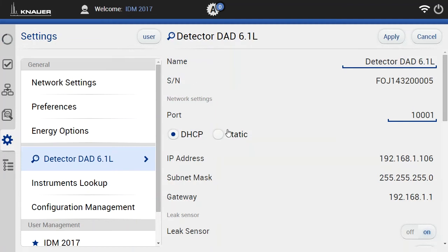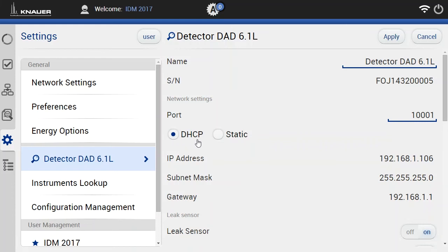So the name, the serial number, and most important for us, the IP address here. And this IP address was automatically given by the router to the instrument via the DHCP protocol. So this here is a dynamic IP.